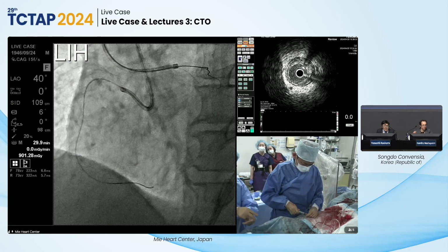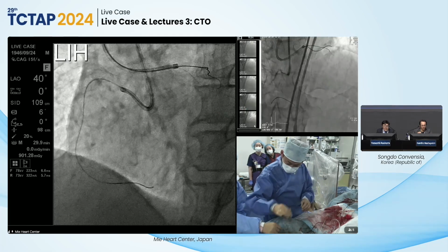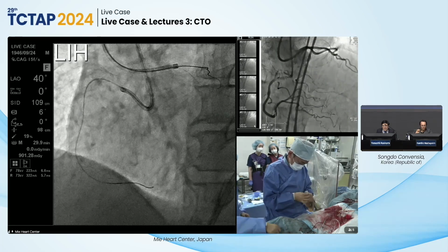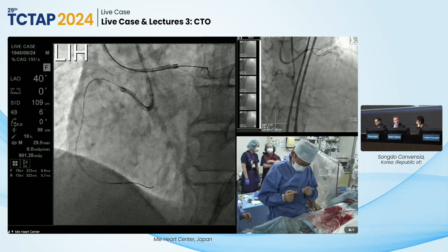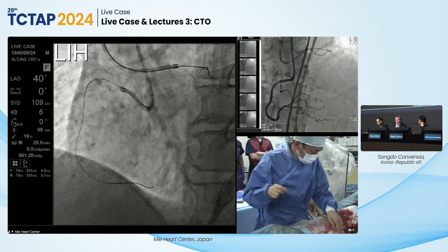But I do think a standard microcatheter does become helpful at a point here. Maybe we're at that point. Yeah, in this situation the proximal site is a very large space, and puncturing from the large space is also very difficult. So in this situation, the double lumen catheter also has a big advantage for puncture.